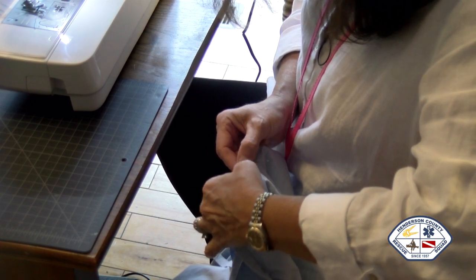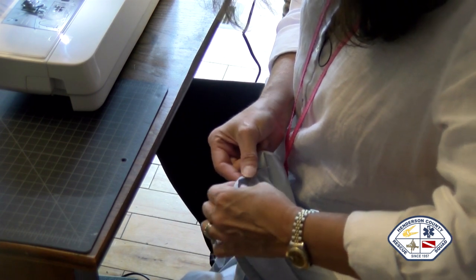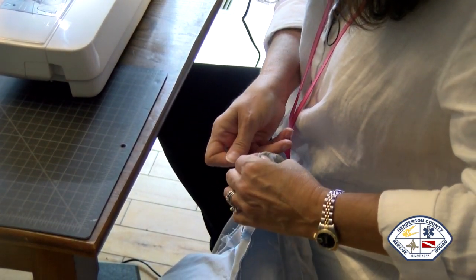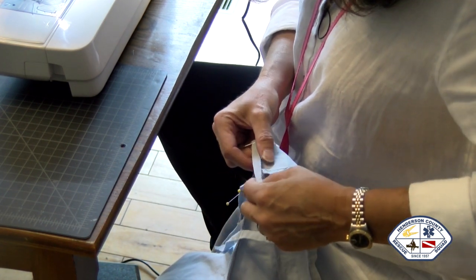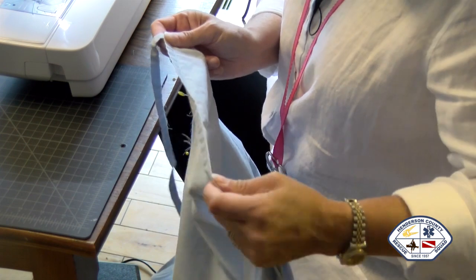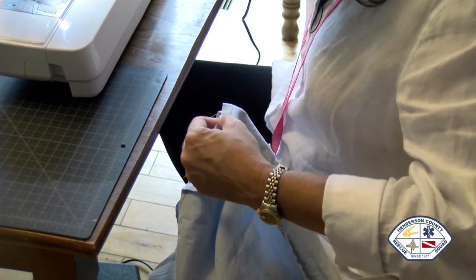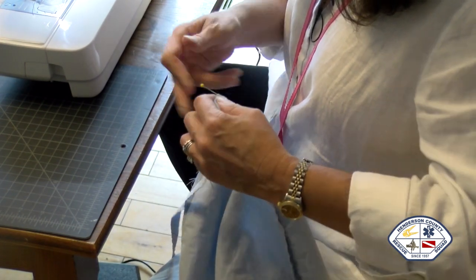And again, this is where if you're a perfectionist, good luck. If you're okay with winging it, that's the best way to do it. Don't get uncomfortable with a little bit of bend in your fabric or your bias tape. And what I've done is the way I cut the sheet, I made sure that the open back of the sheet, when I cut it, was along the edge of the sheet that was already hemmed. So I'm using their hem instead of having to go back and re-hem something. It's just a little bit of work smarter, not harder.